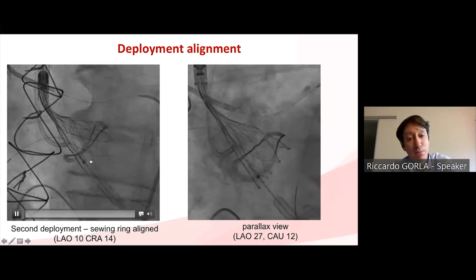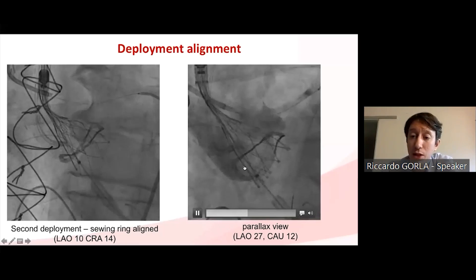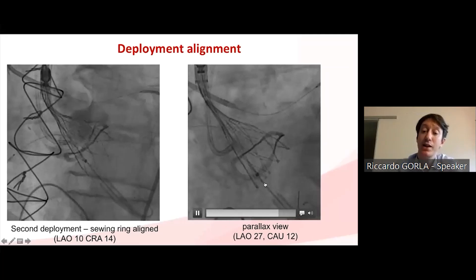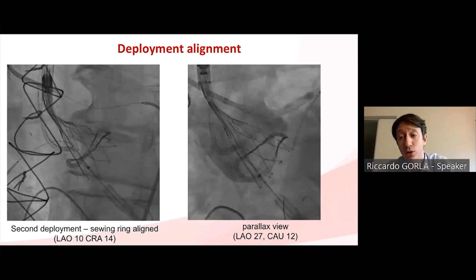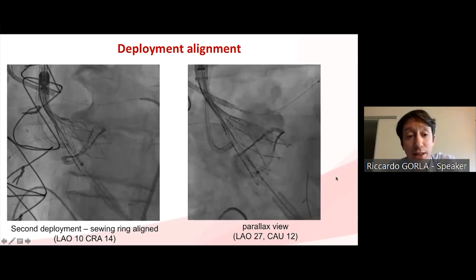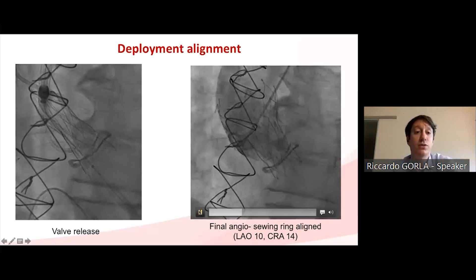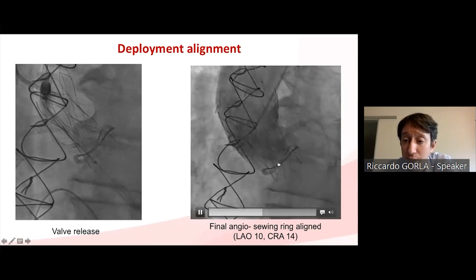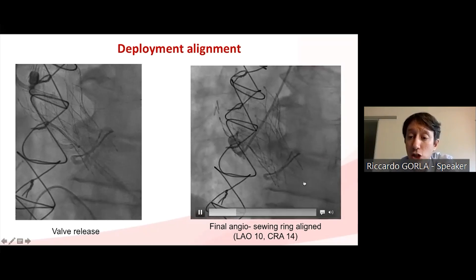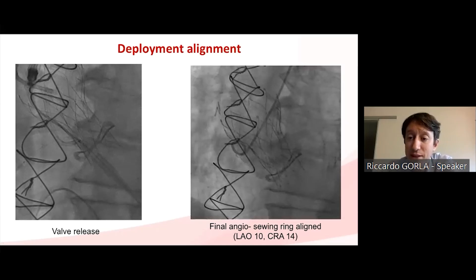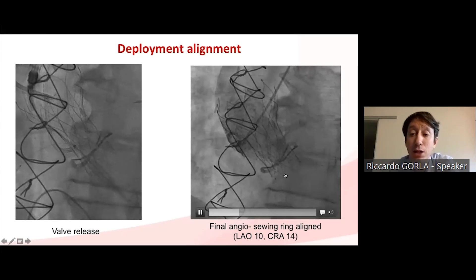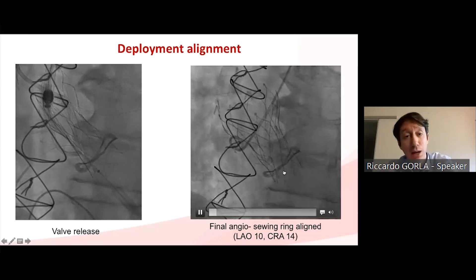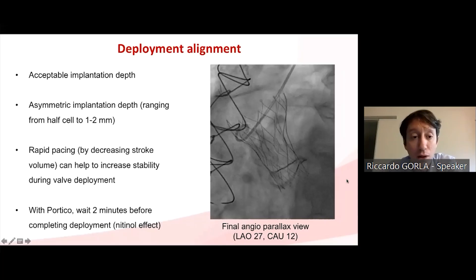On the second attempt, two stent struts were slightly deeper into the left ventricle. Checking again in the parallax view, we could clearly see all stent struts below the sewing ring of the Mitraflow. We were satisfied with this result and proceeded to the second part of the Portico deployment. The final result shows an asymmetric implantation depth, with some struts two to three millimeters below the sewing ring and others about half a cell below — approximately six to seven millimeters — which was acceptable.